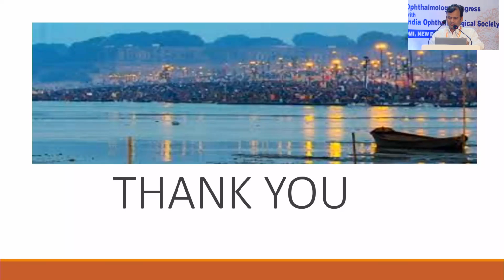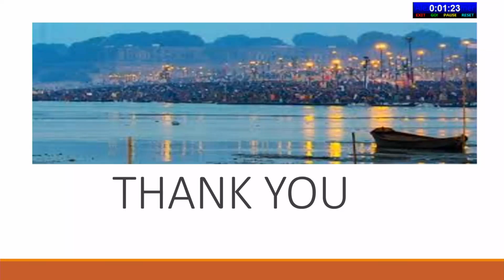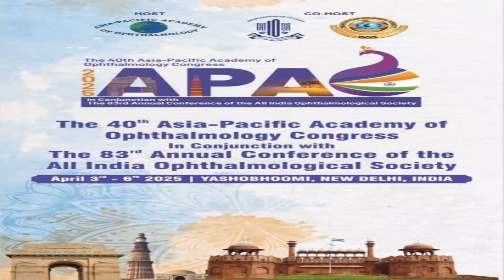Thank you. Thank you, Dr. Punat, for a nice presentation. In certain situations, a lot of complications happen with anybody, even in expert hands. So management is very important. They have shown very nicely how to manage it and how to implant the posterior iris lens in a very short time. Thank you.